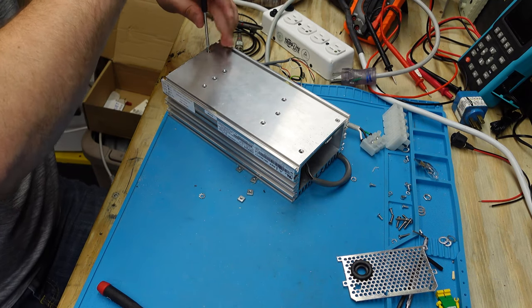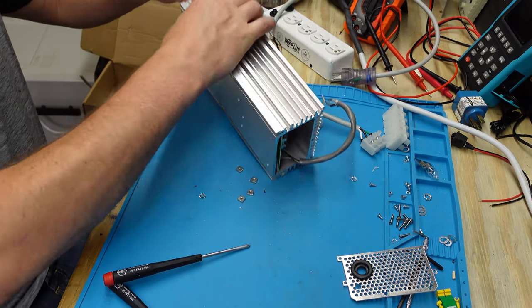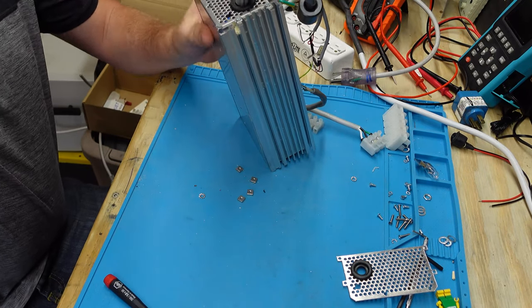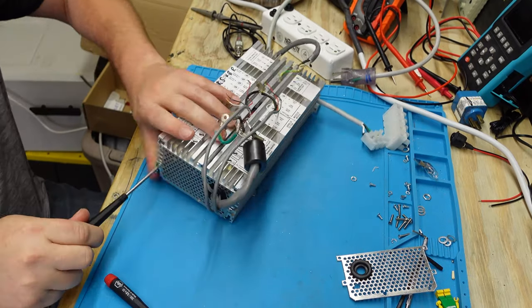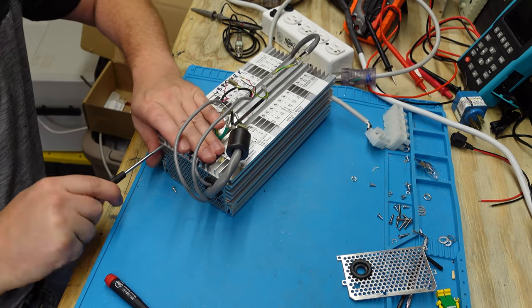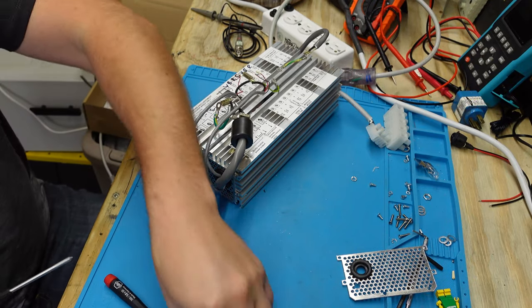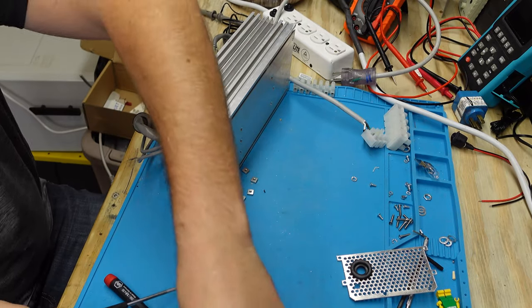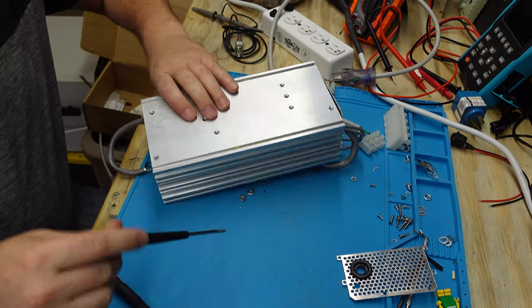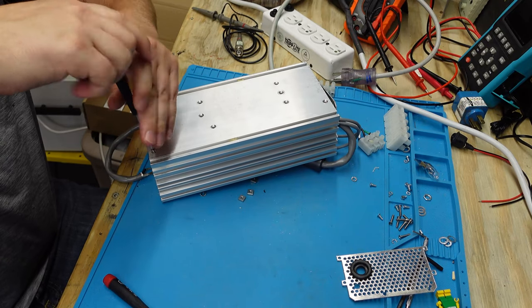There we go. And the last side is going to be this side. Four more. And they all should be done. I should have used a power screwdriver on this. I had no clue that there's going to be that many fasteners. All right. One last one. Wow. I just don't get it, guys. I really don't get it.